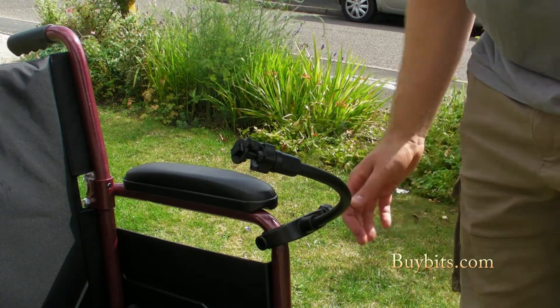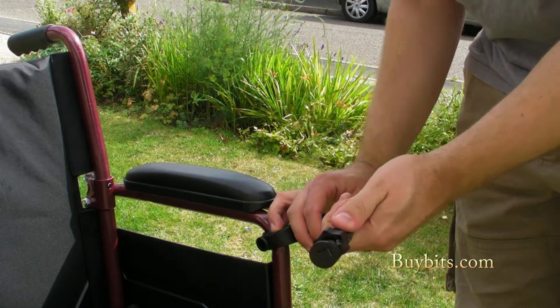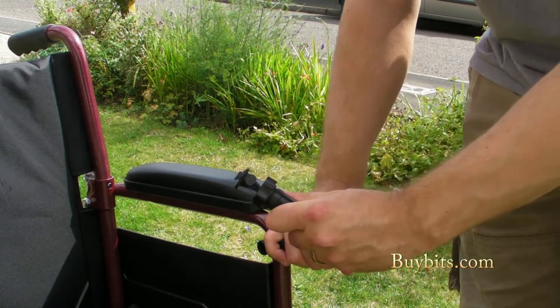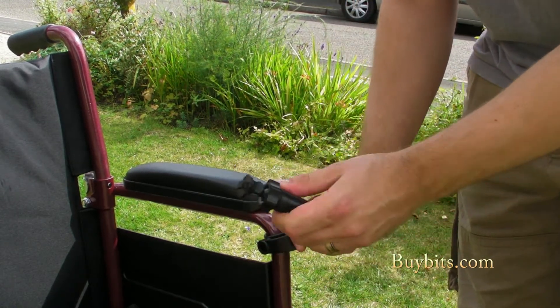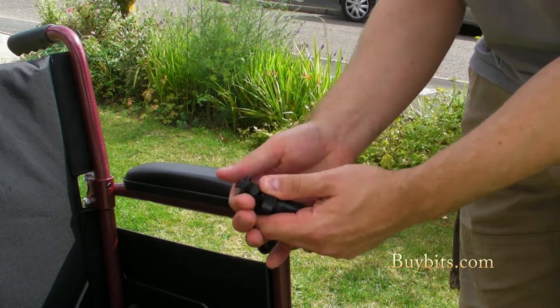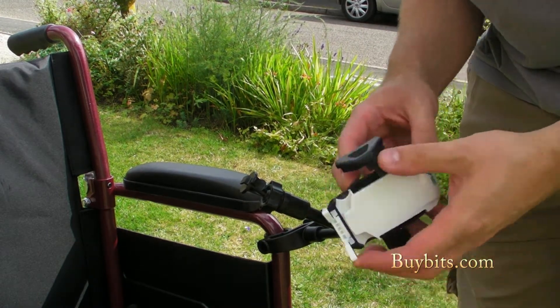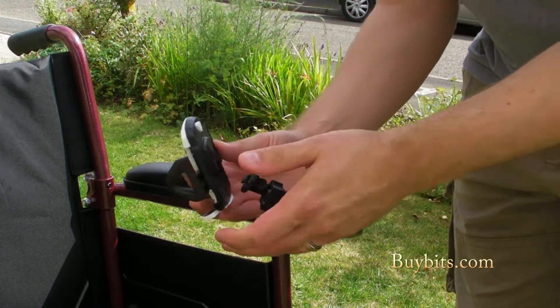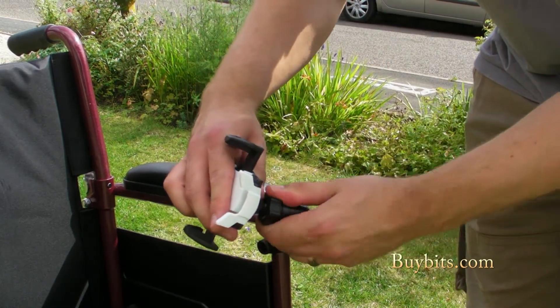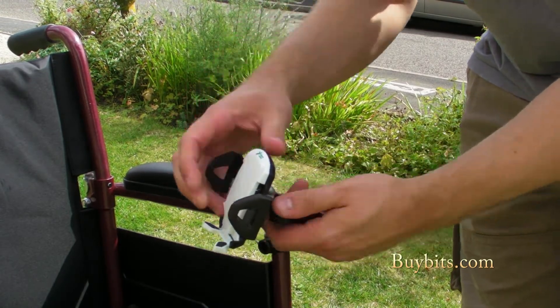We're ready to mount our cradle on it. You've got an 18cm flexible arm here — that's 9 inches for those of you who are imperialists. You can set any angle you want to avoid glare or get it in a position that suits you. There's also a ball and nut joint that you can use to set a fine angle. I've got my Universal Ultimate Addons cradle here that I'm going to slot on — that's one of any number of cradles you can buy. Just adjust the angle so it's nice and straight.